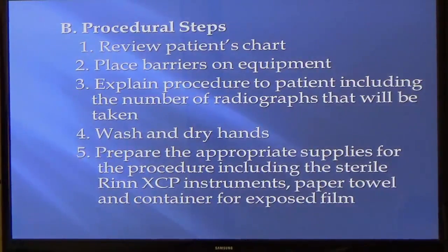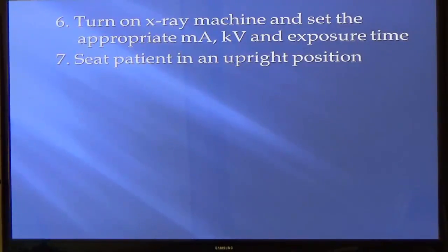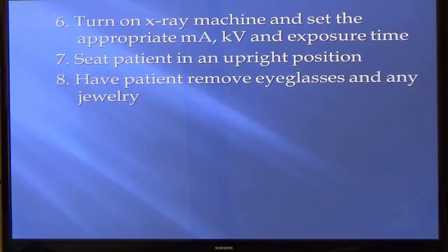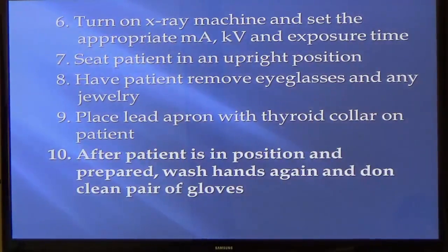Make sure your hands are clean. You don't have to have your gloves on while you're setting things up. Your gloves go on right before you start going in the mouth. You can put the bib and the lead apron on the patient, have everything laid out, and then right before you start, put on your mask and then your gloves. Make sure the machine is on and everything is proper. Make sure the patient is in an upright seated position. Remove jewelry and eyeglasses. Place them with the apron, then put on your gloves.